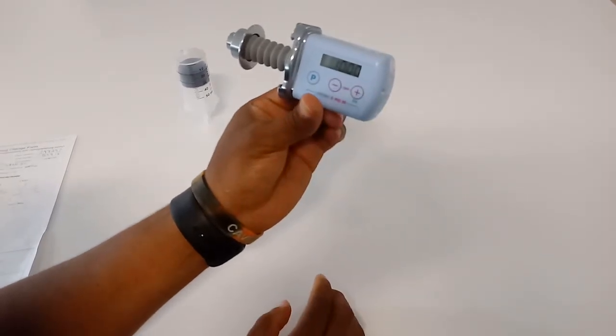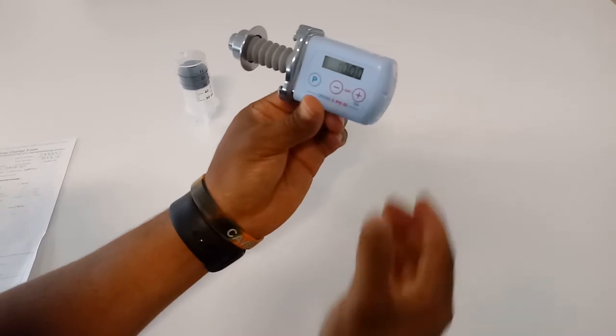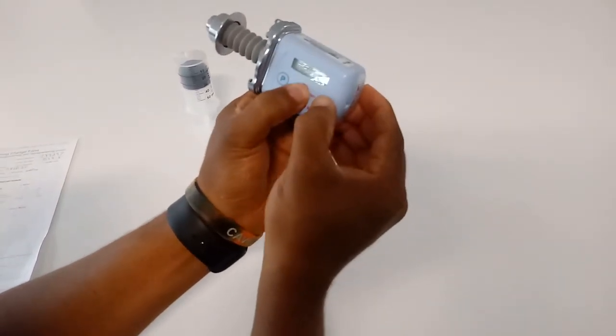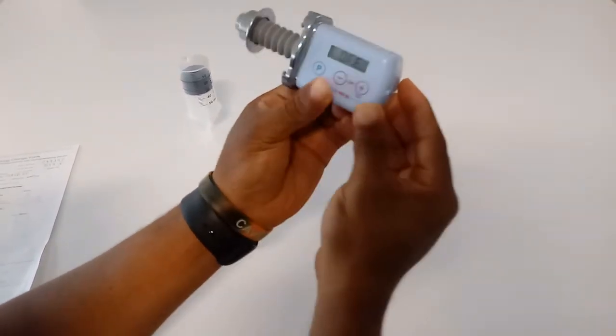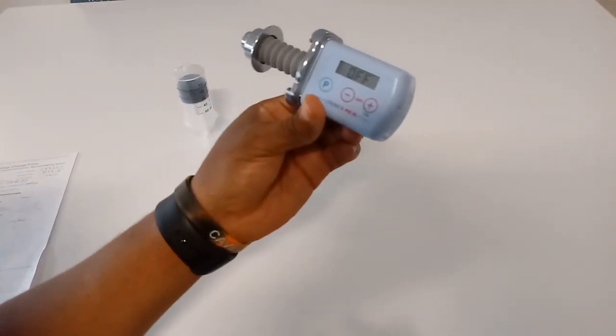You stop. It's going to blink for a while. It's going to stop by itself. Once it stops, that's it. You turn the pump off by pressing the two buttons simultaneously. It's off. Now, how do you know that you programmed the right thing?